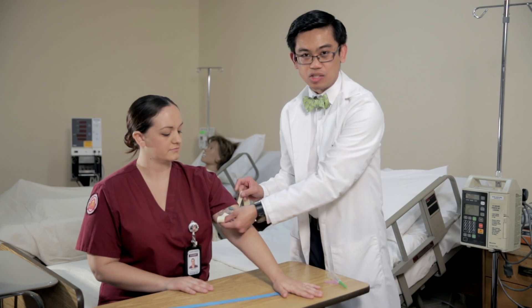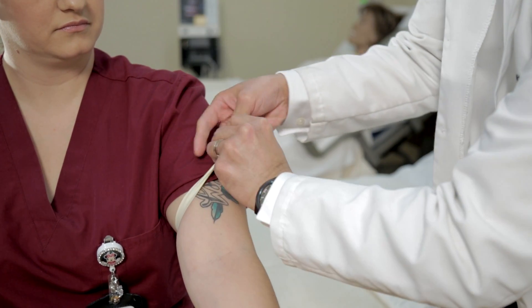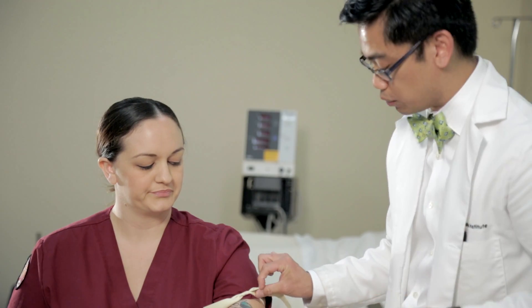People have the misconception that application of the tourniquet is similar to that of when you tie a shoelace. This is the incorrect way to do this.